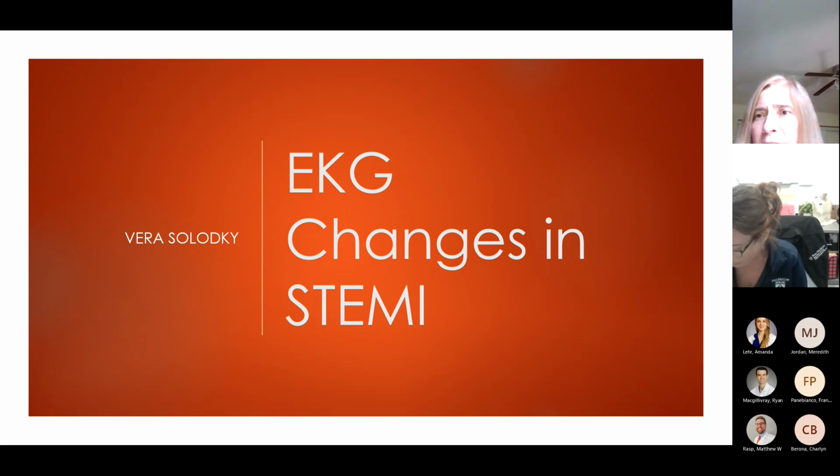Okay, I think I'm going to start now. So I'm going to talk about ECG changes in STEMI.